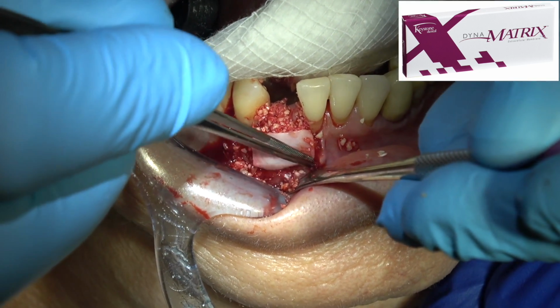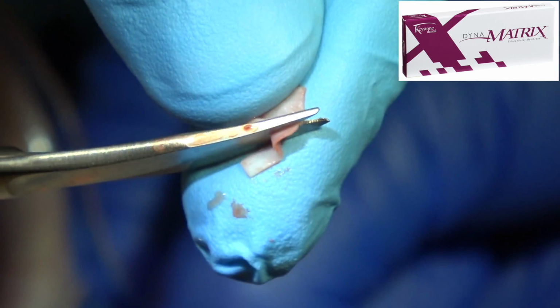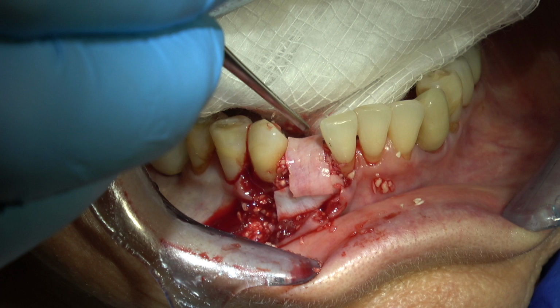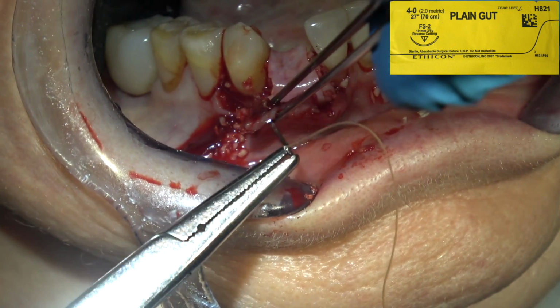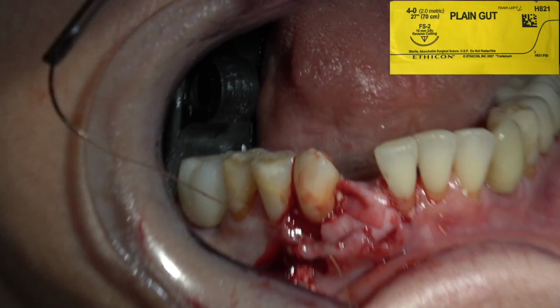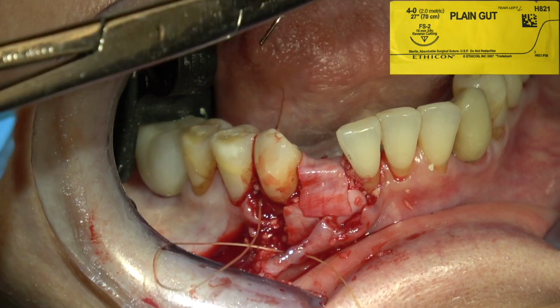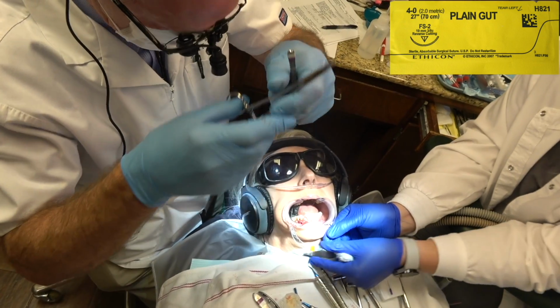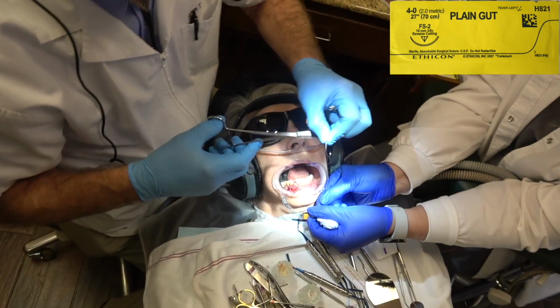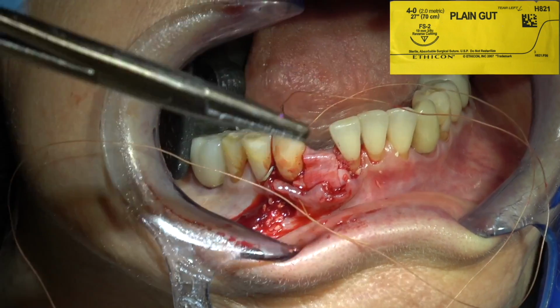So I'm cutting the corners off and contouring it. I want some under the soft tissue. I want to cover that whole facial of missing alveolar process. I'm going to cut one part that goes over the top and one on the facial. Now, in this case, I'm going to use 4-0 gut suture because it's pretty delicate stitching. Remember, I left the papilla so I'd have some soft tissue to suture into.